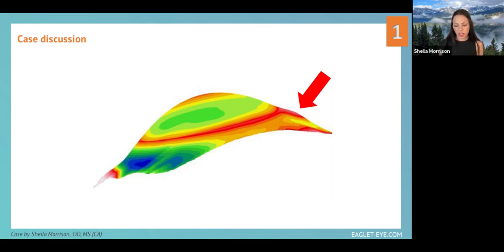And for this patient, I gave him options. He had a choice of using a lens with a vault or a notch, a micro vault, or, because he traveled from out of town, he was given the option to go ahead and be fit with a freeform design. And he chose freeform. So that's what we did for him.